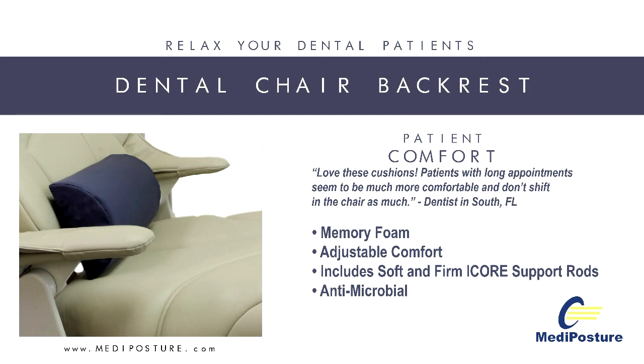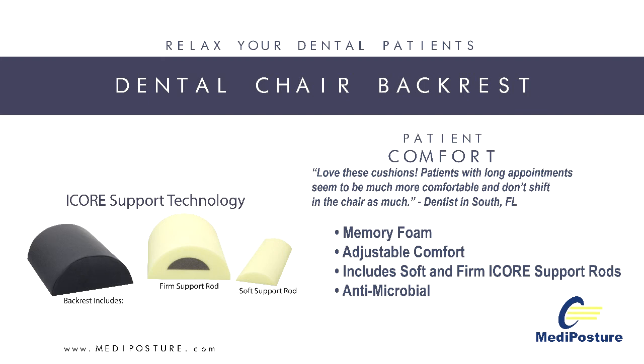Metaposture has developed a revolutionary adjustable memory foam dental backrest design that offers customized lumbar support for patients in the dental chair.